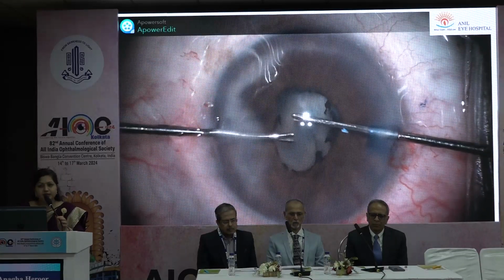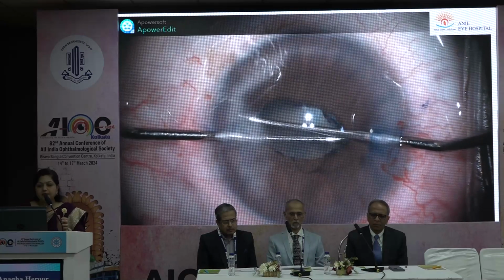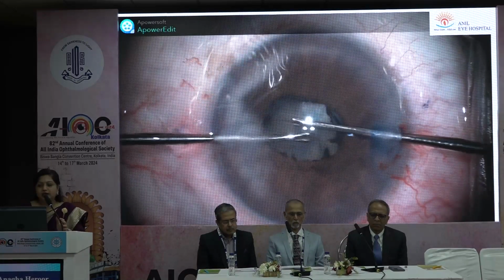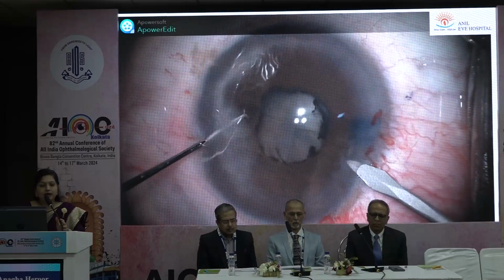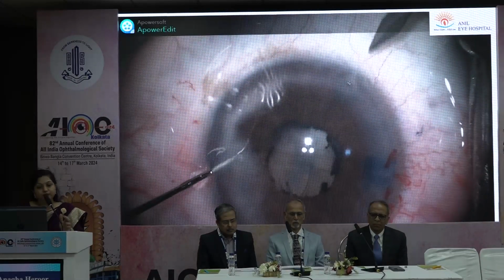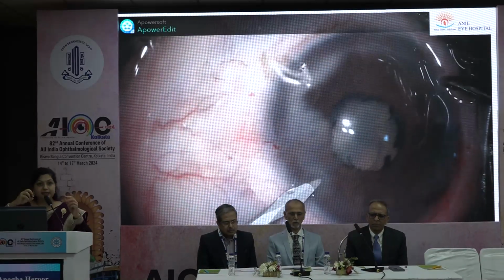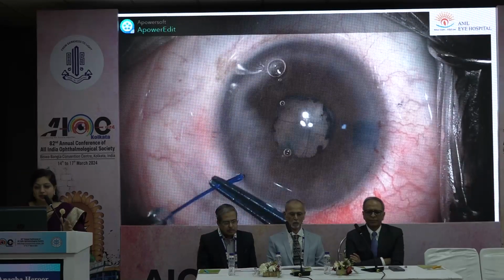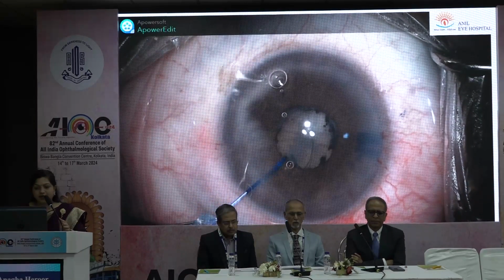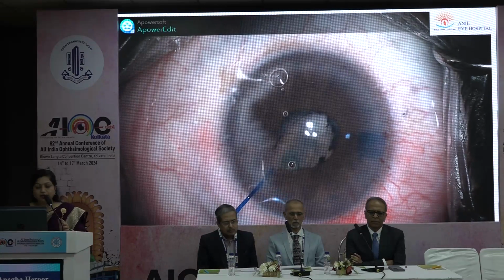Nowadays stretching from limbus to limbus is not really recommended, but here, because I would be planning to use a pupillary expander, I decided to do a very gentle stretching. Without stretching, if you go ahead and use iris hooks too tightly, it can cause irregular tears in the iris sphincter, which can cause an irregular pupil. So now we are putting in iris hooks.